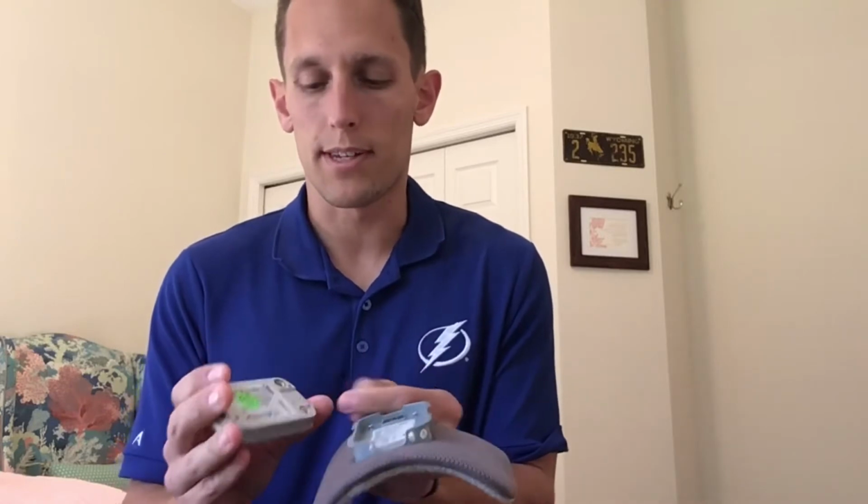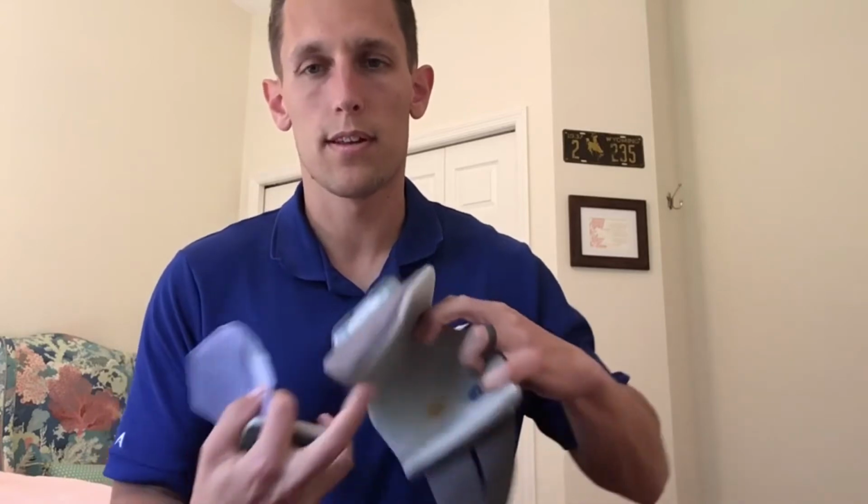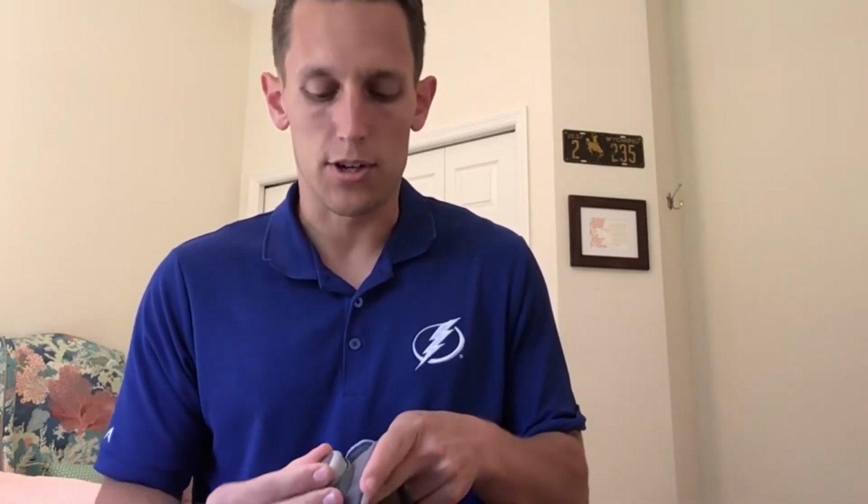Let's say in the very rare instance, none of that helps. What may happen is there may be some buildup of material in either the ports behind the EPG or the ports where the electrode goes. In those ports, you can clean that with rubbing alcohol. And that should also resolve the errors if that was giving you the error in the first place. So sometimes what can happen is that corrosion builds up, it causes an open electrode fault or it can't complete the circuit basically.